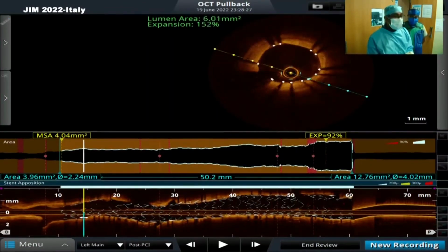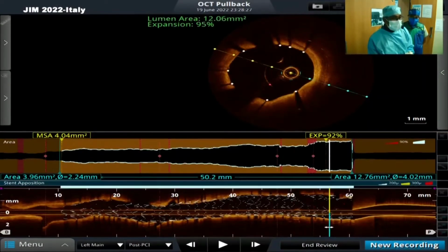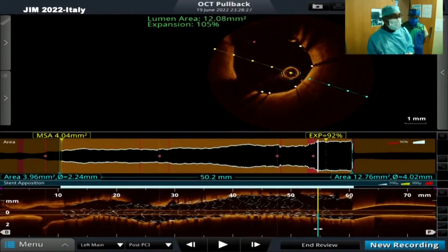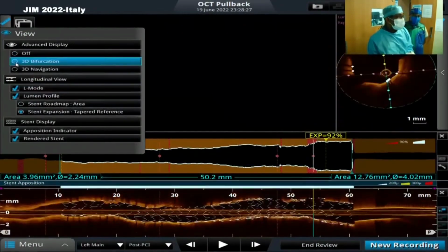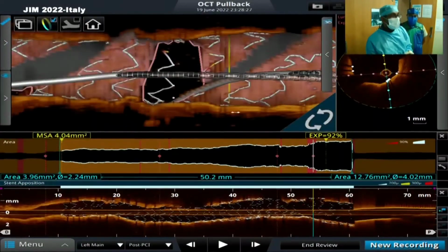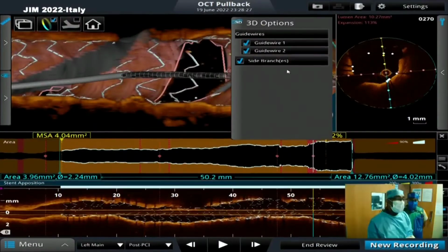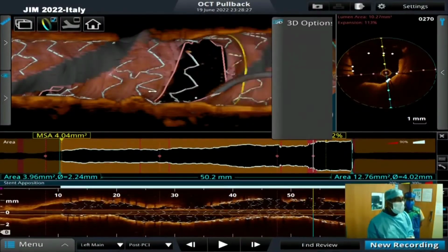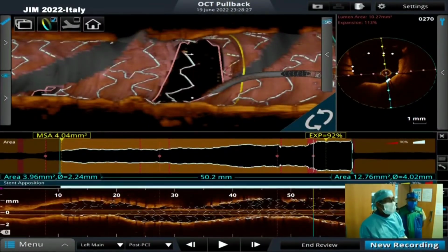But prior to that, as we come more proximally, I would want to go to the bifurcation mode just to see the circumflex ostium. We'll just go to the circumflex ostium bifurcation mode. Yeah, just rotate. Well, that's the circumflex ostium. We are very fortunate that there is no significant links over there. We are just seeing the crowns seated over there, but there are no links.